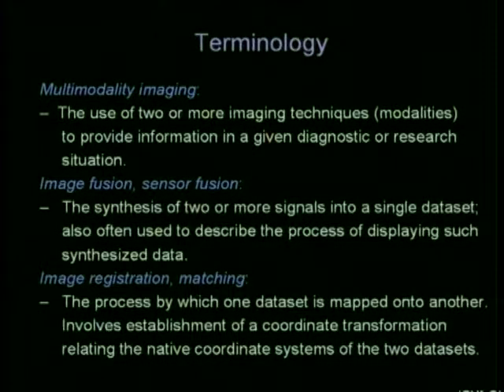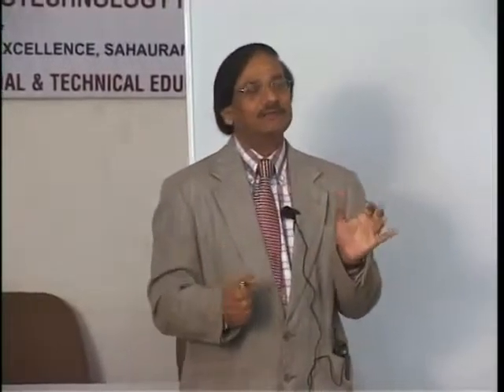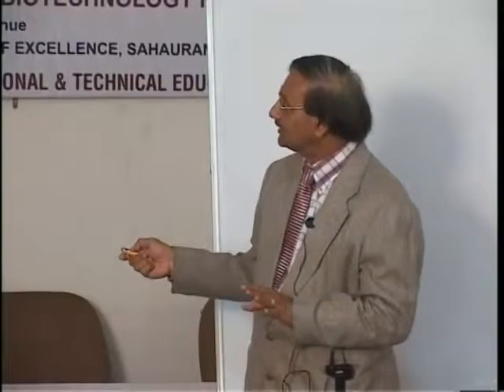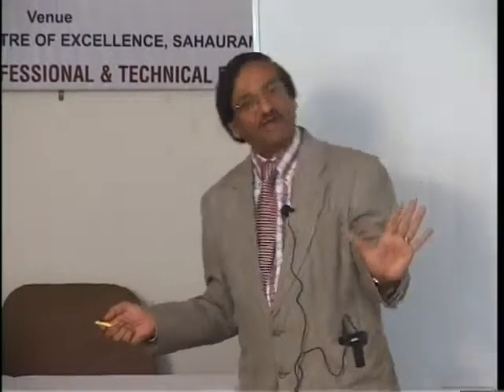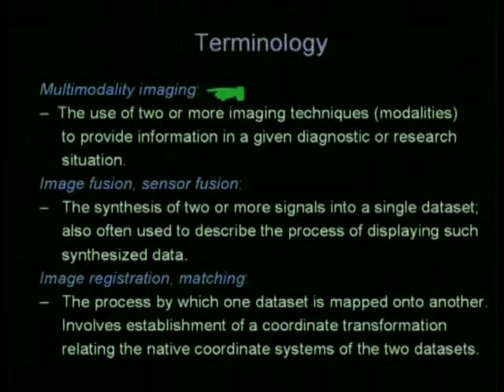There is certain mixed terminology that is used. Anything that comes, fusion imaging, fusion sensors and multiple things like that. But then terminology has to be very defined. Multi-modality imaging means when you are using 2 or more imaging modalities to image a patient. This is too simple.